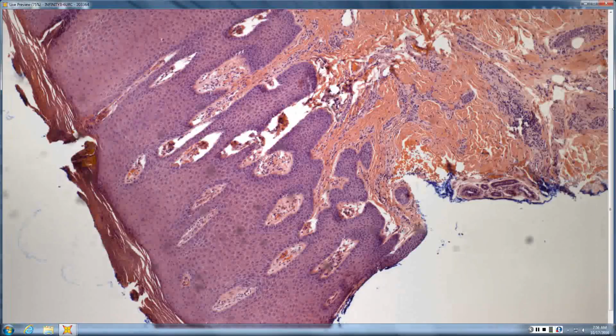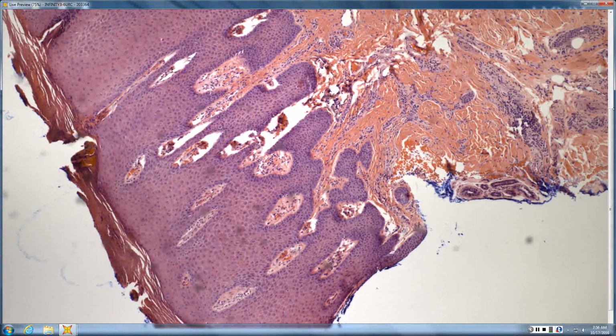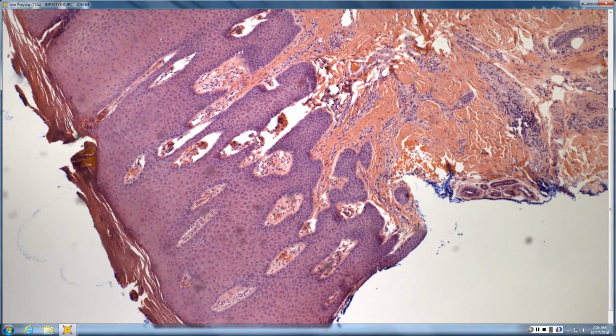Put it all together, it looks like LSC, lichen simplex chronicus, and there's definitely some serum and active spongiosis, so a very chronic scratched or rubbed dermatitis. The changes of lichen simplex chronicus would be the wedge-shaped follicular hypergranulosis, the irregular acanthosis, and the vertical streaking of the collagen in the papillary dermis. And then still active spongiosis and serum, telling you it is a scratched, rubbed dermatitis.